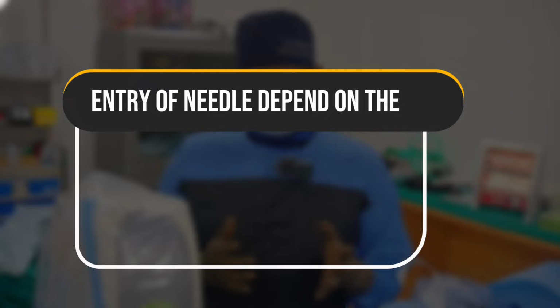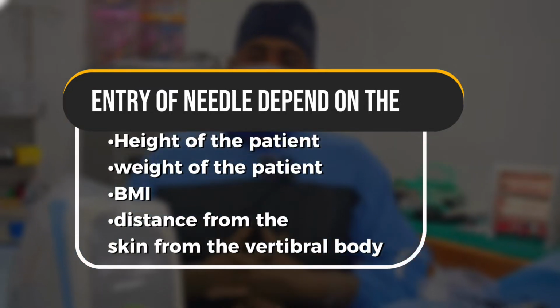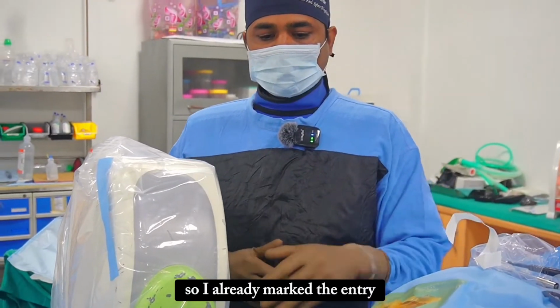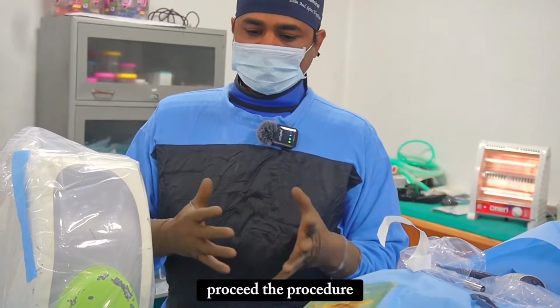The entry of the needle also depends on the height of the patient, weight of the patient, BMI, and the distance from the skin to the vertebral bodies. So I already marked the entry. Now we will proceed with the procedure.